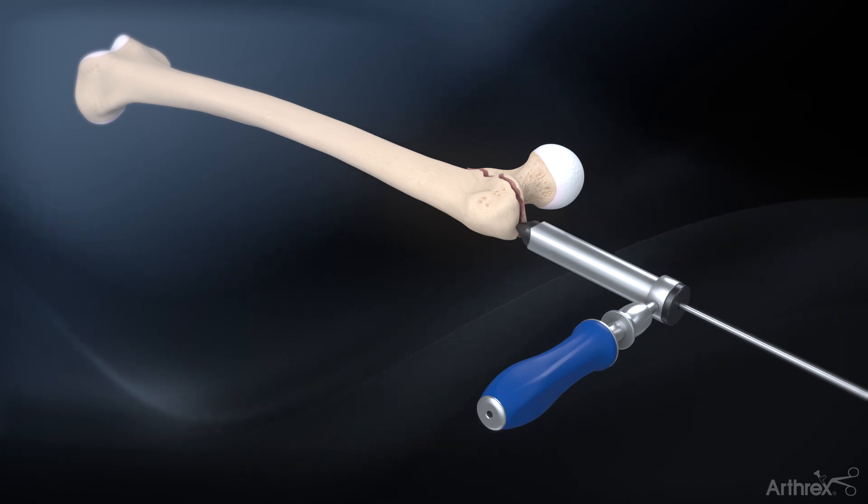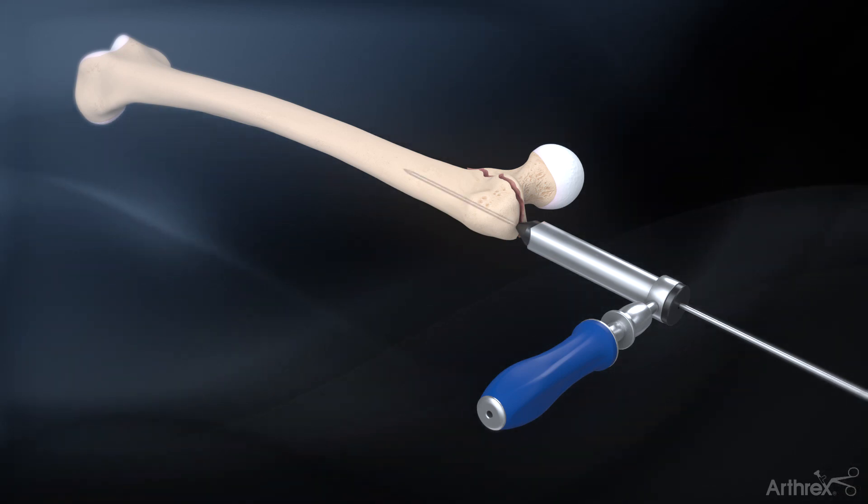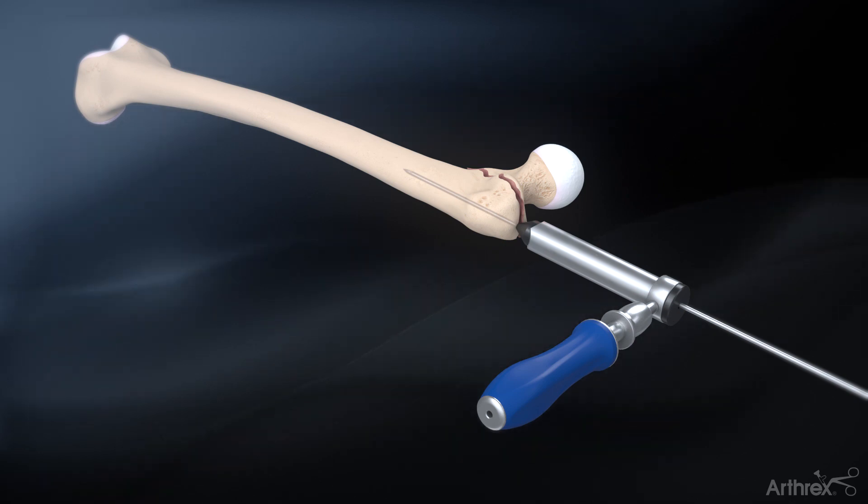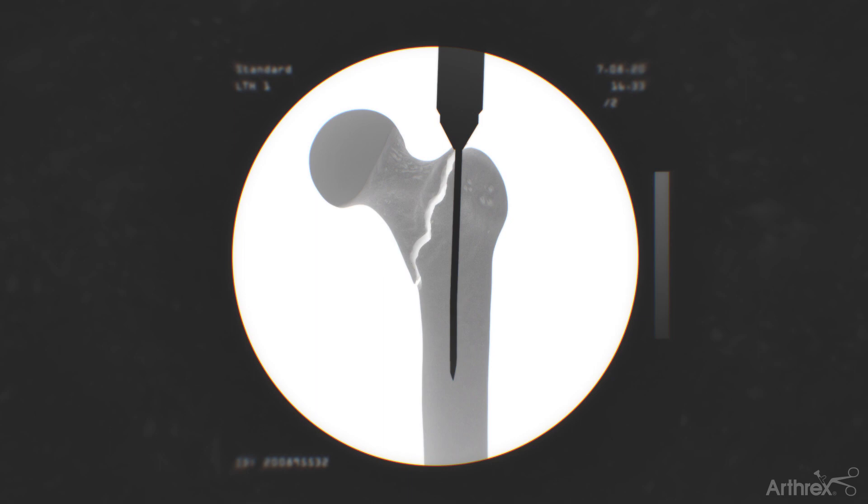Insert the 3.2 mm guide pin through the soft tissue protector and aim towards the central axis of the femoral shaft. Advance at least to the level of the lesser trochanter. The pin trajectory is verified through fluoroscopy.